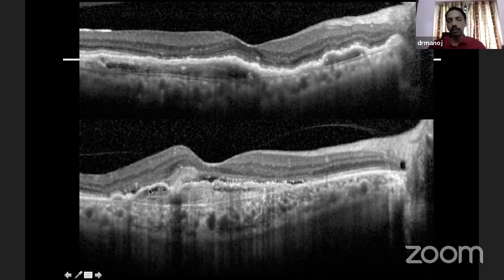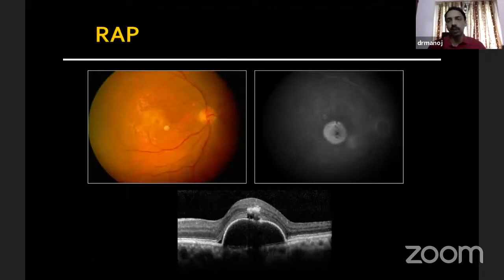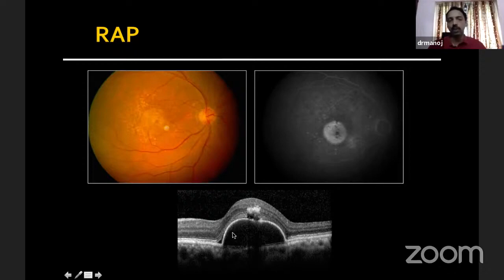Whereas in this patient, you see there is migration of hyperreflectivity going on top of the retinal pigment epithelium — so this is a mixed CNVM where there is both type 1 and type 2, or both classic and occult CNVM. OCT helps us understand the exact location of the choroidal neovascularization. This is a typical OCT of a patient with RAP — retinal angiomatous proliferation — where you see this reflectivity in the retina and also an element of pigment epithelial detachment.